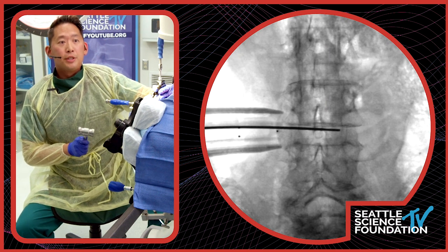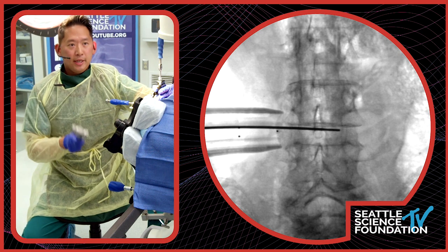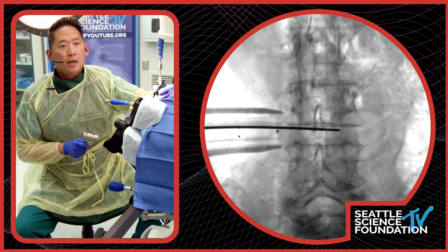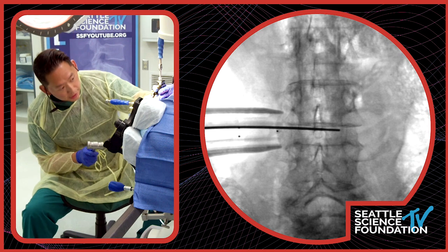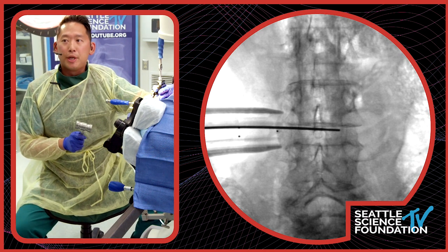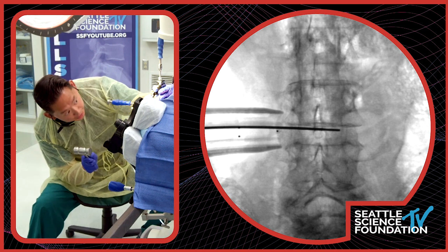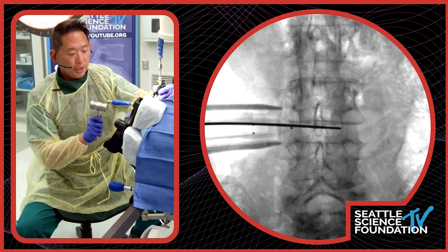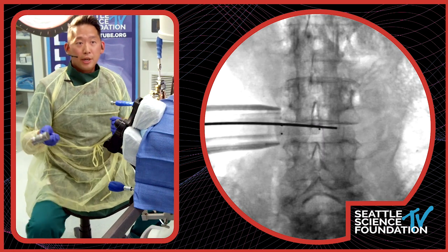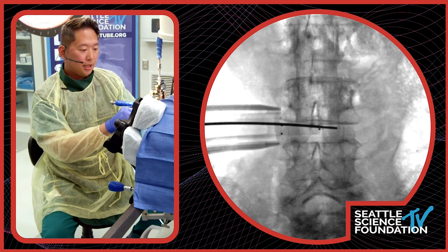You can see the shim — the radiopaque markers form a triangle. We basically want that lead point going into the disc space. Looking down into the retractor, we've got it pretty close to where the wire was. The wire was a little bit posterior in the disc space, so I think this will work out nicely. You can see the shim going into the disc space — and here it's fully deployed. Let's get the camera down so we can see in here.